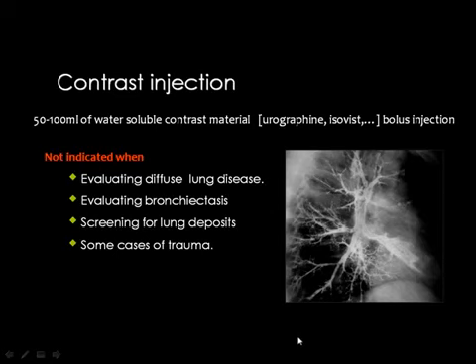Then if the patient is going to be injected with intravenous contrast, he should fast for about 4 hours. If you don't need to inject the contrast material during the scan, then you don't need fasting. What are the conditions where you don't need contrast material?